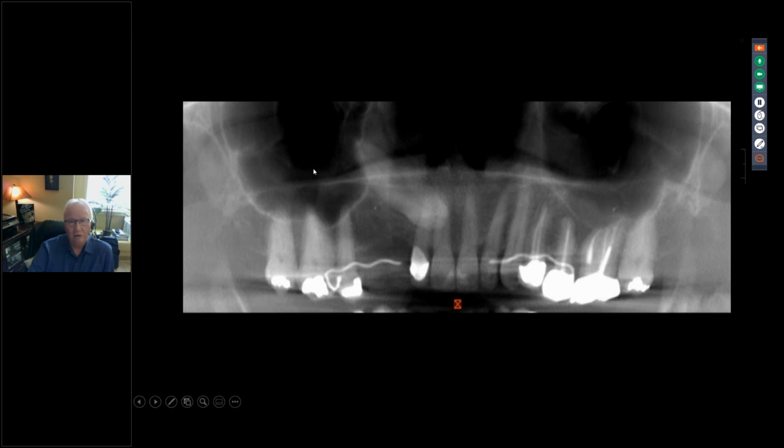Now, here is a partial panoramic. This is actually reconstructed from cone beam, but it had a really nice impacted tooth number 6, or if there's any international folks out there, tooth number 1-3. They left the little partial in there, obviously, because here's the wires coming from the plastic. But for localization, this is a difficult task in 2D imaging. Okay, so 3D for implant, 3D for localization is amazing.